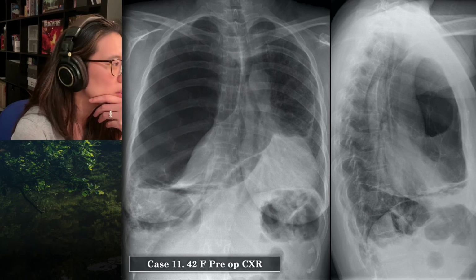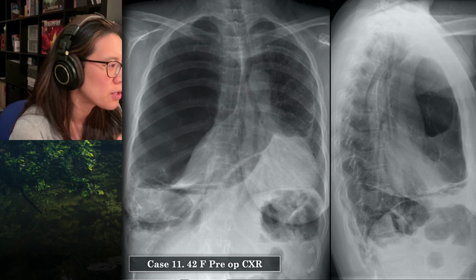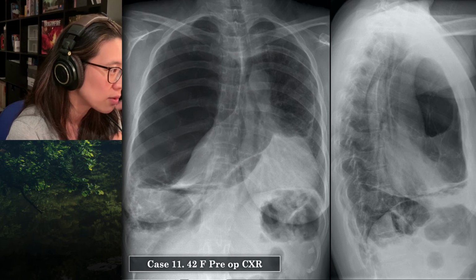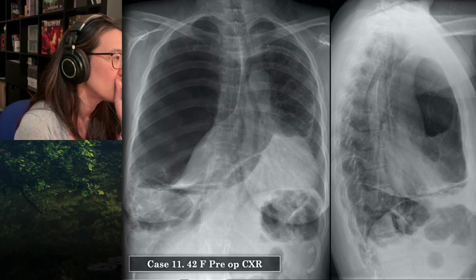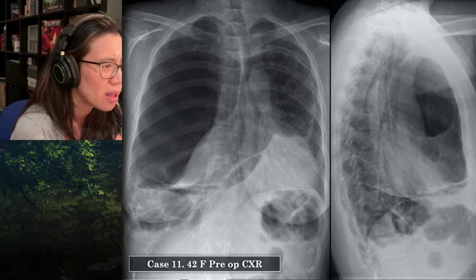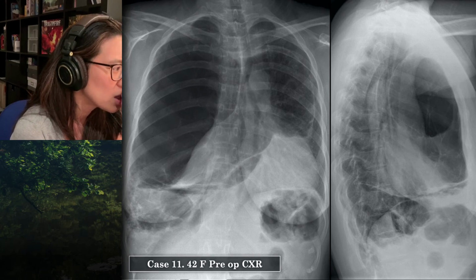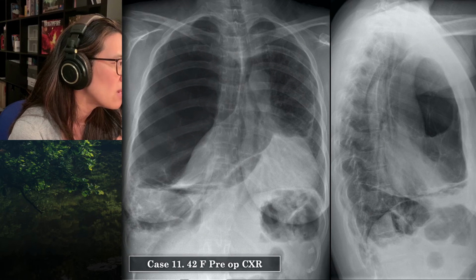So I'm not certain. Initially, when I first saw it, I was concerned that that could be a pleural edge of the left lung with a pneumothorax on the left, but I think I can actually see lung markings beyond that. So I'm not sure whether that's what that represents, and it's quite thick. It's thicker than I would expect for a pleural edge. And I can see the lateral margin, and inferiorly I'm unsure where it continues. And I don't know where the medial portion is.